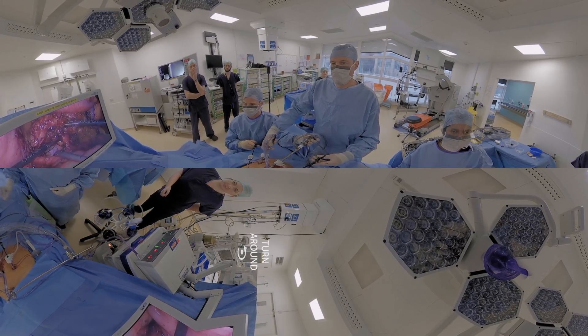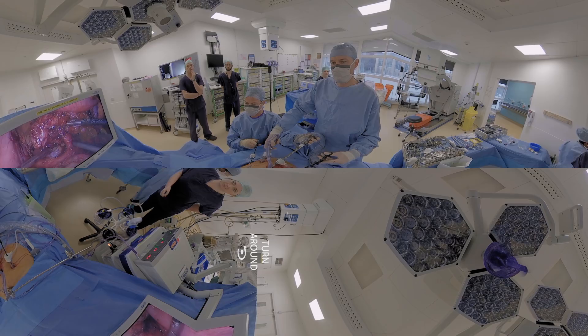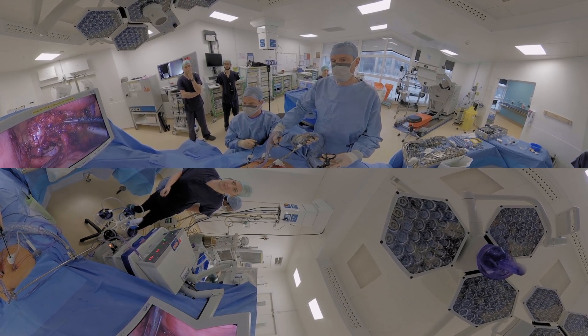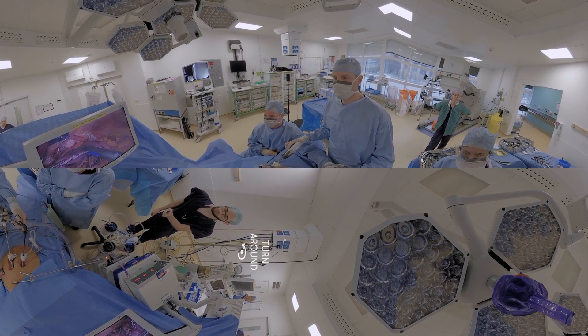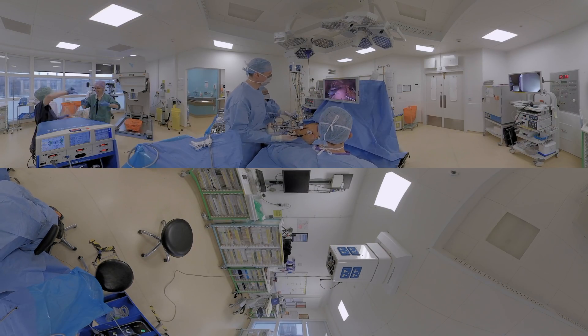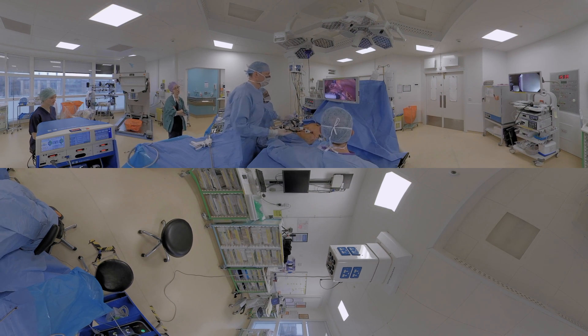We are at the back of the stomach, and what we have done is taken all of the lymph nodes that may have cancer in them, and we're about to divide the main blood supply — the main arteries of the stomach. Right now I'm making a tube out of the stomach. That's going to replace the esophagus that we take out in the chest, and then the stomach tube gets pulled up into the chest and attached to the end of the esophagus.